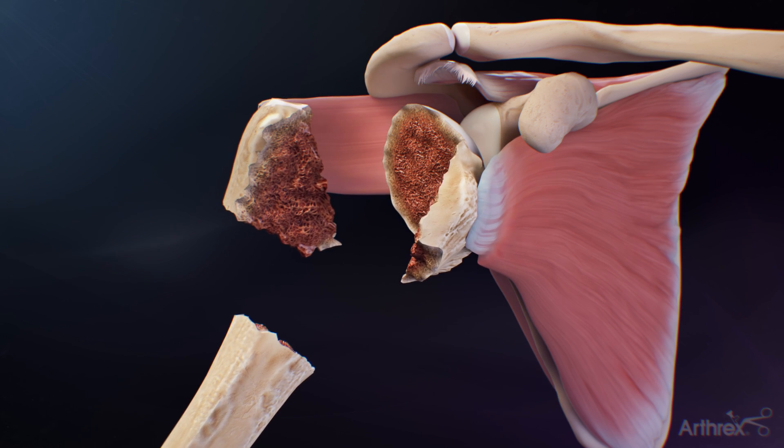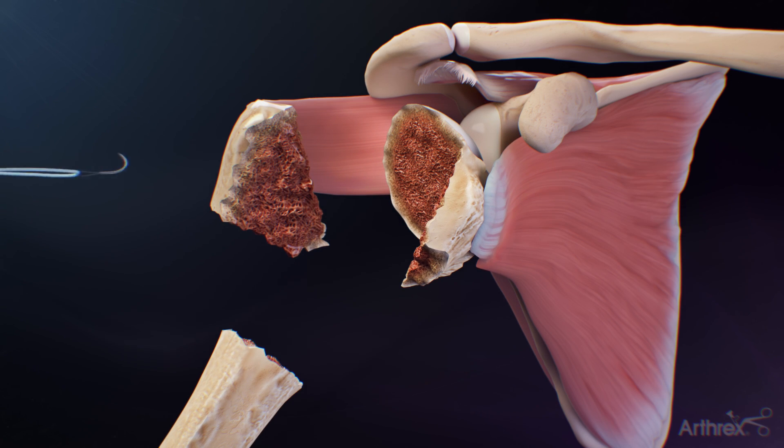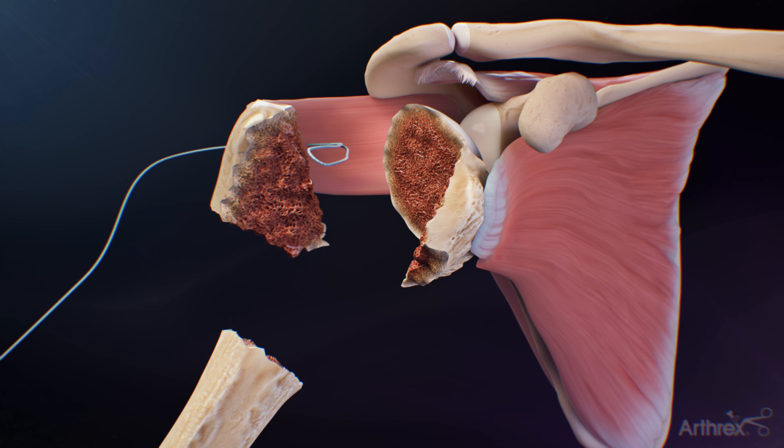Identify the proximal humeral fracture pattern and begin the repair by passing the blue number two fiber link inside out through the infraspinatus tendon at the bone tendon junction. Repeat this process with the white-black number two tiger link going through the inferior portion.